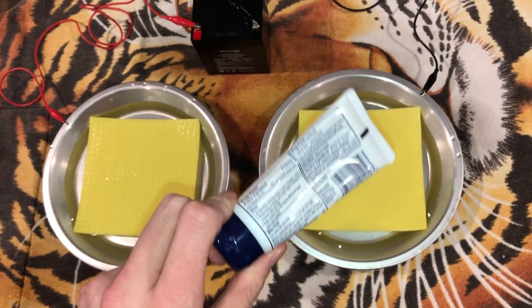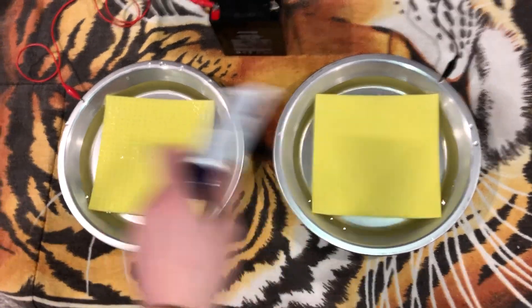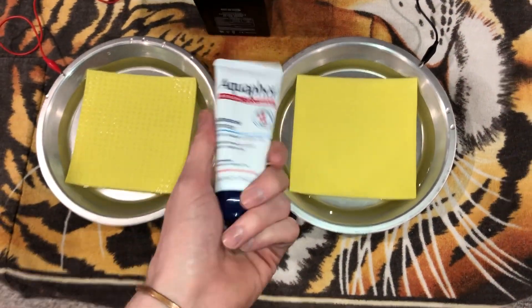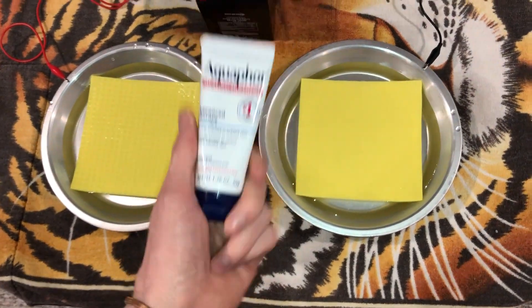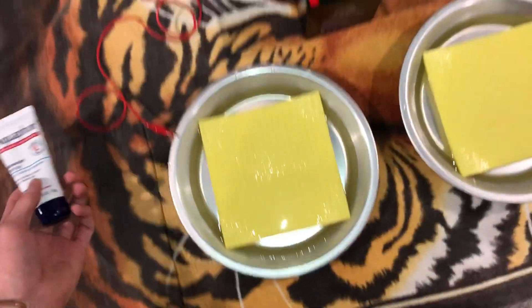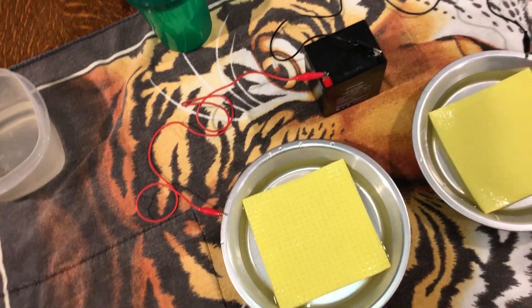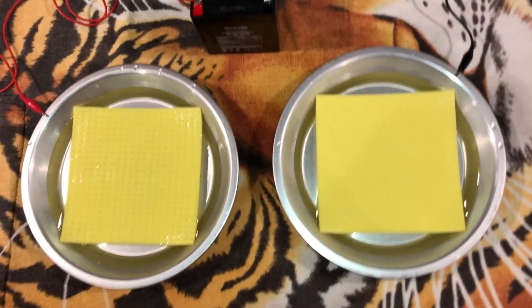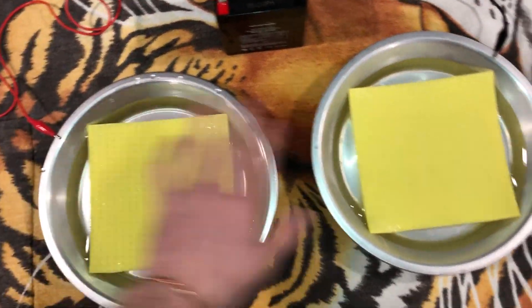Make sure to put aquaphor on your hands, your fingers, anywhere that's going to be involved in the process. This will protect and moisturize your skin, keeping it from being more irritated than it already is. That's a big help.